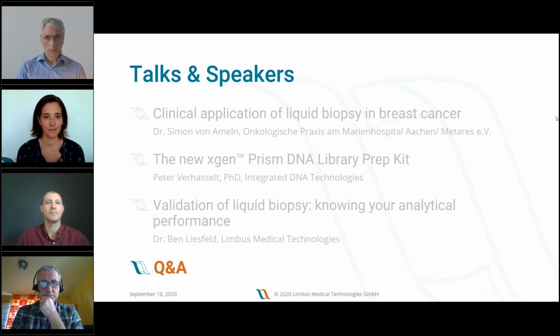There are several things to consider with clinical samples, however. Those samples must be characterized to a high degree. And you also have to keep in mind that if you characterize those samples using next generation sequencing, the probability of finding any variants that you haven't found before is very low. So you're comparing very similar technologies. Make sure that you also have reference samples in your validation set that challenge your own technology and that have been characterized with other technologies as well.